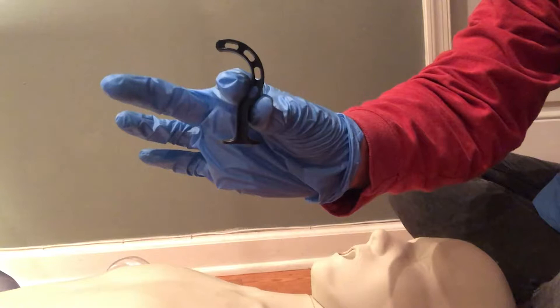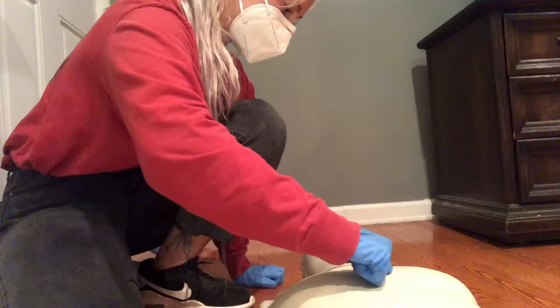Multiple oral airway sizes are available. The right size is one that reaches from the person's lips to the corner of their jaw.